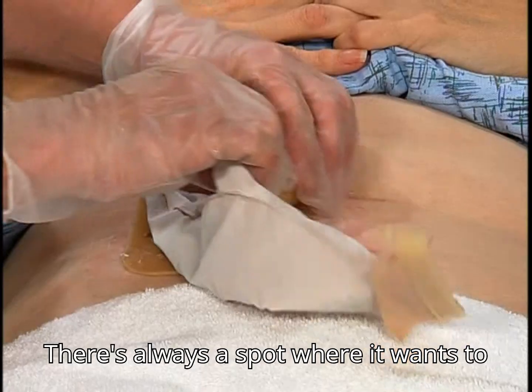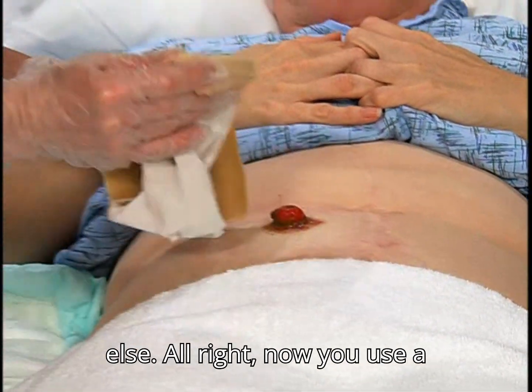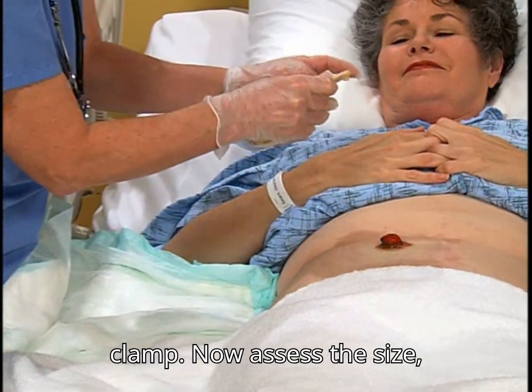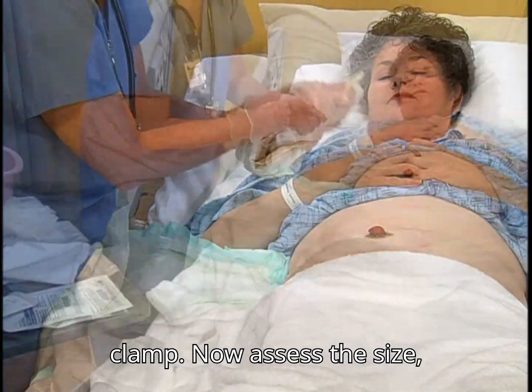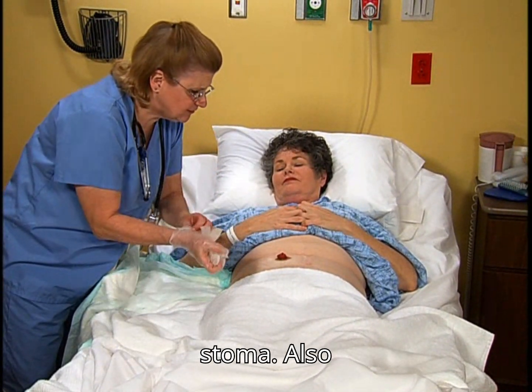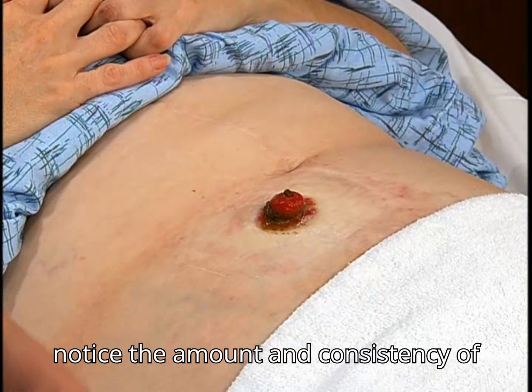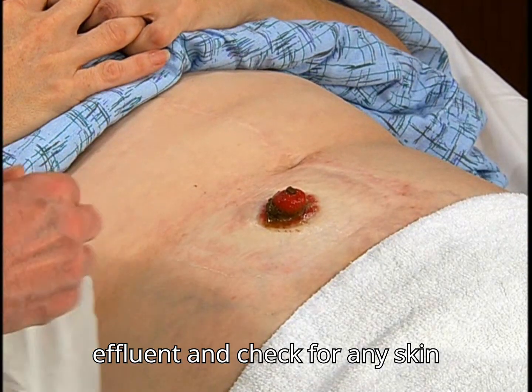There's always a spot where it wants to stick a little bit more than everywhere else. Now assess the size, shape, type, and color of the stoma. Also notice the amount and consistency of effluent and check for any skin irritation.